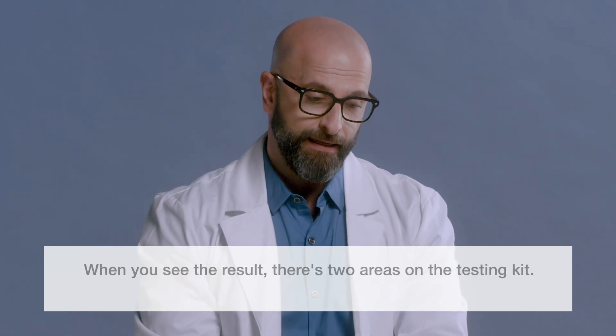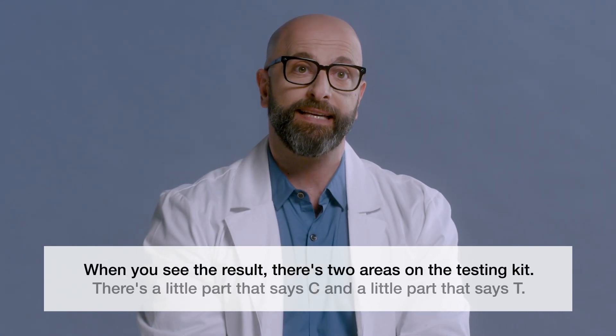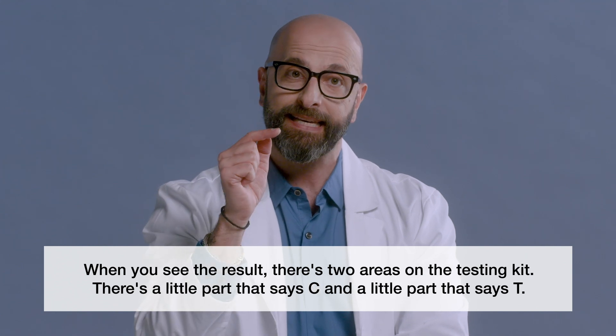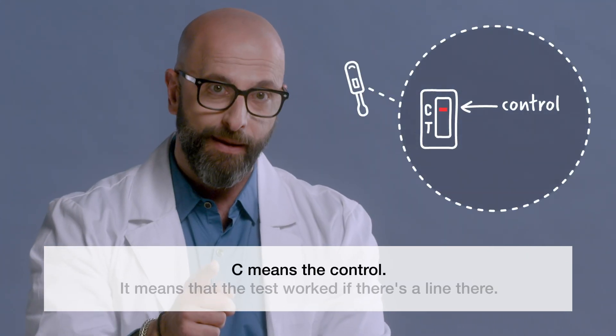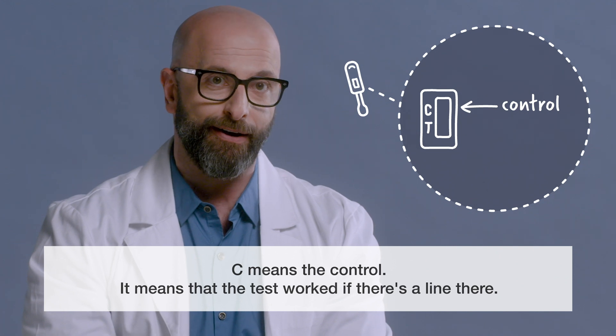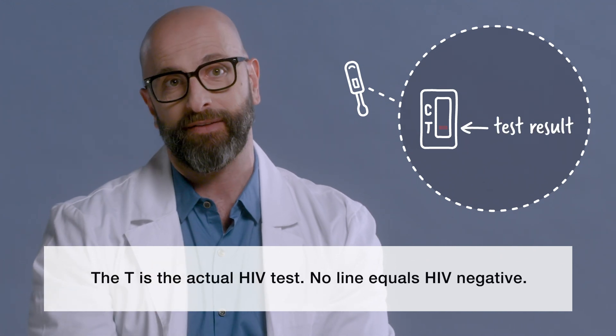20 minutes. When you see the result, there are two areas on the testing kit. There's a little part that says C and a little part that says T. C means the control — it means that the test worked if there's a line there. The T is the actual HIV test.